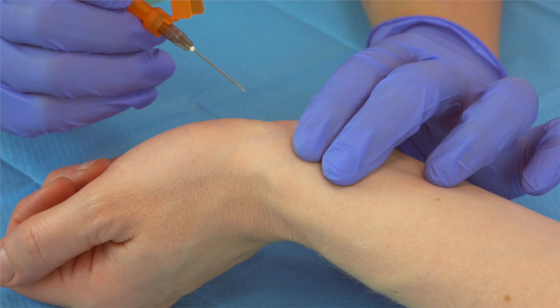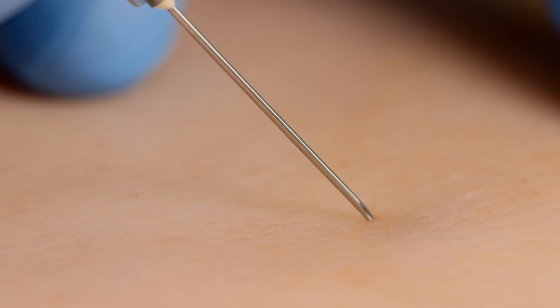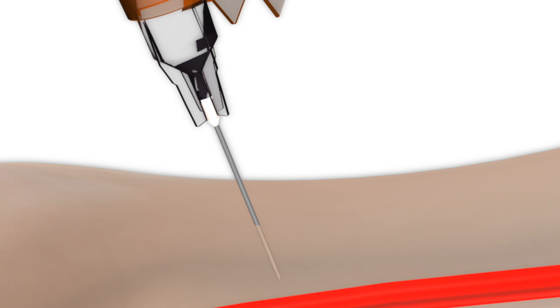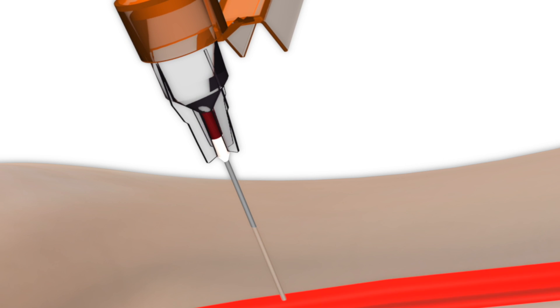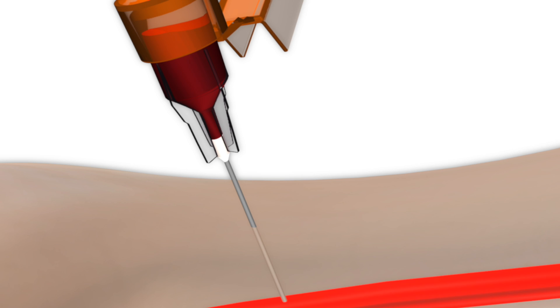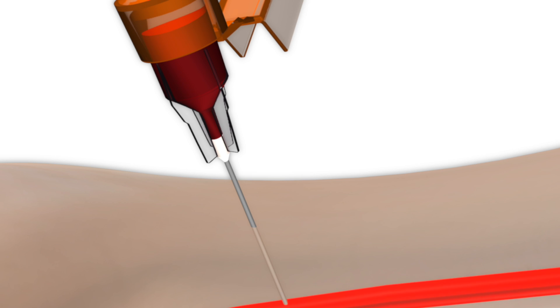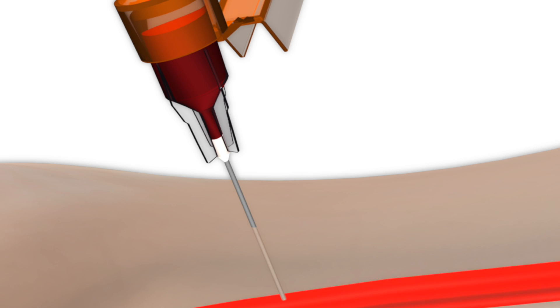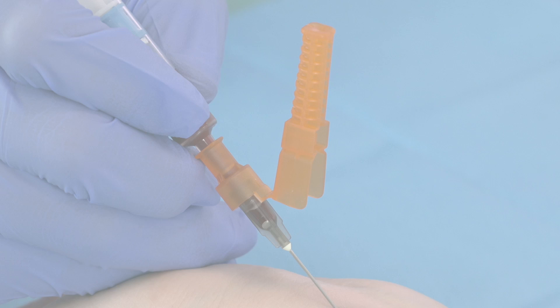Once palpating the artery proximal to the point where we are going to insert the needle, slowly introduce the needle at 45 degrees to the skin, in the direction of the artery. As the needle punctures the lumen of the artery, there will be a flashback and the syringe will automatically fill with bright red arterial blood, often in a pulsatile fashion. If you see an initial flashback but the syringe doesn't start to fill, you have most likely passed through the back wall of the artery as well.